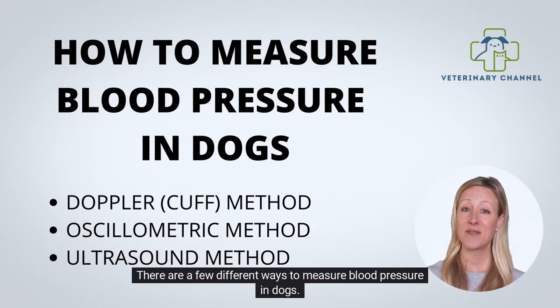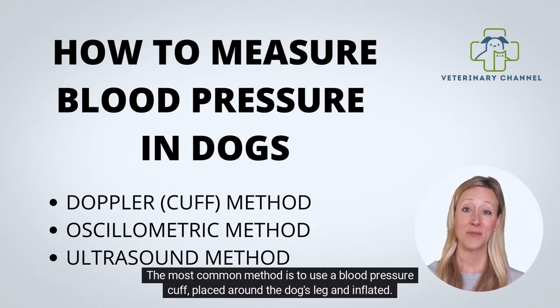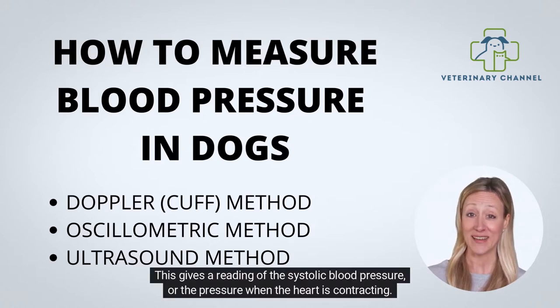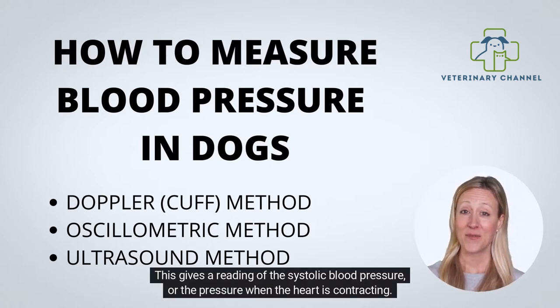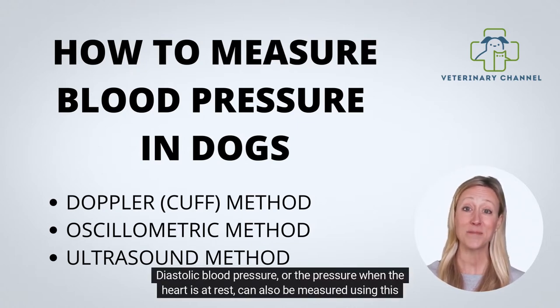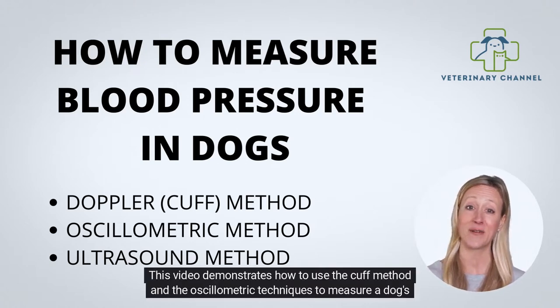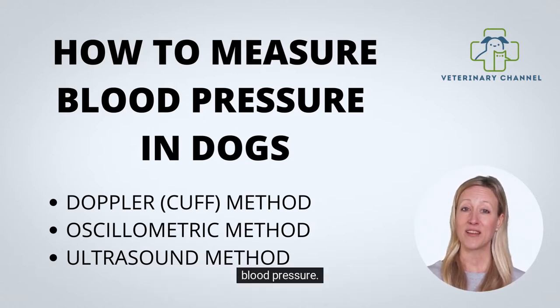There are a few different ways to measure blood pressure in dogs. The most common method is to use a blood pressure cuff placed around the dog's leg and inflated. This gives a reading of the systolic blood pressure, or the pressure when the heart is contracting. Diastolic blood pressure, or the pressure when the heart is at rest, can also be measured using this method. This video demonstrates how to use the cuff method and the oscillometric technique to measure a dog's blood pressure.